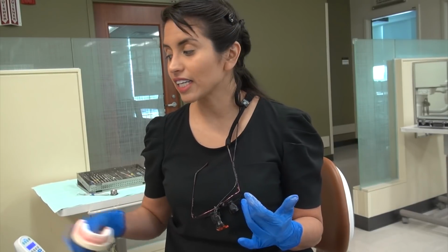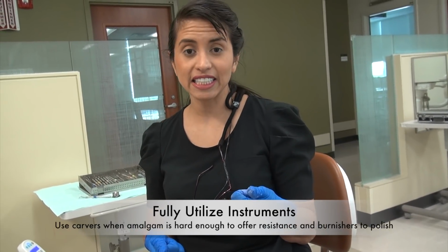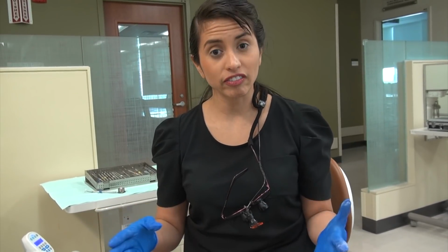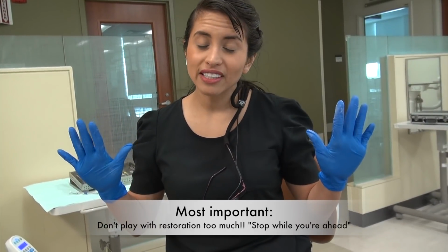And the final thing is making sure that you are properly using your burnishers, both the beaver tail and the PKT, and then finishing with the carvers. Now, you don't want to play too much with it. You want to be able to manipulate it just enough, but stop while you're ahead.